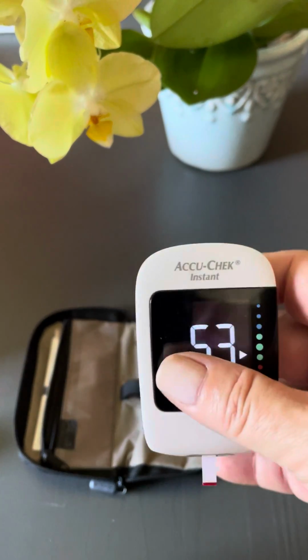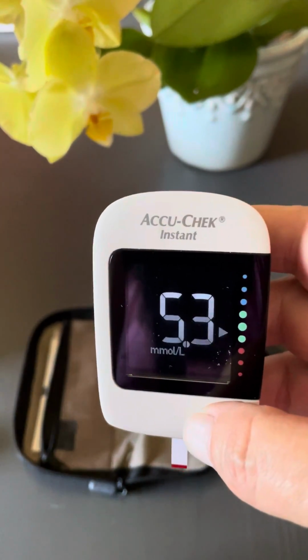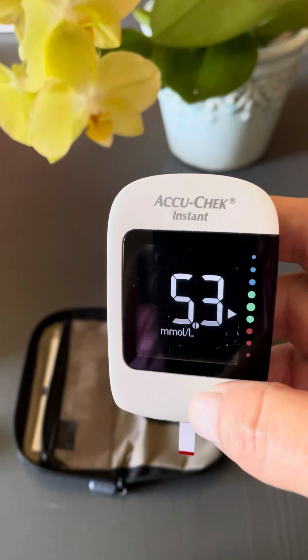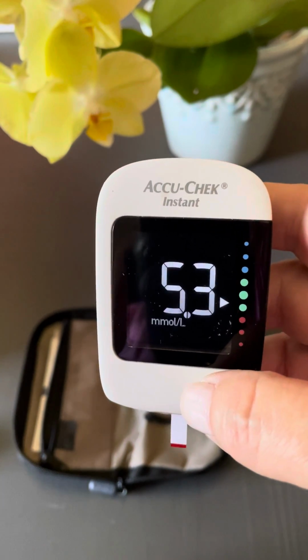So with this machine, I can do regular quick checks. I can also look at averages of 7 days or 30 days.